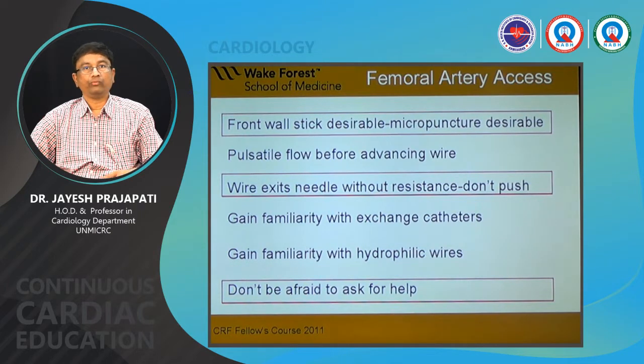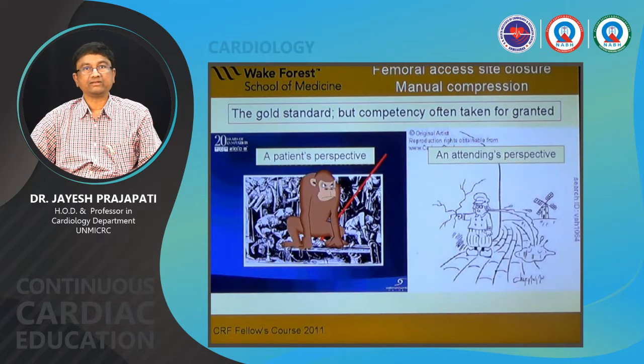And of course, all days are not yours. So what happens? Suppose you are not able to prick, call your colleague or a superior and say that the puncture is not coming. You can take help from someone. You can move from the right femoral to the left femoral, so change the puncture site. Don't prick too much. So that is one thing to keep in mind.